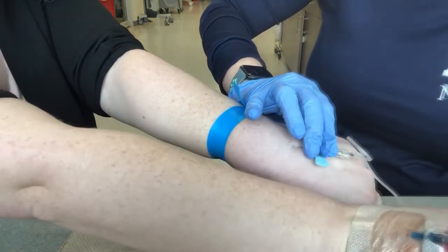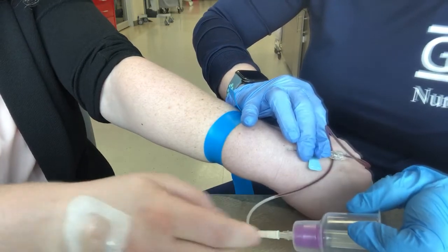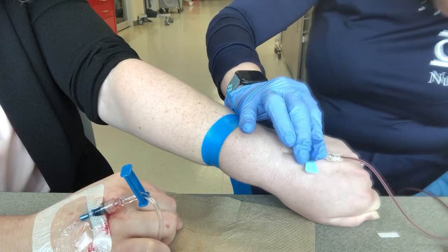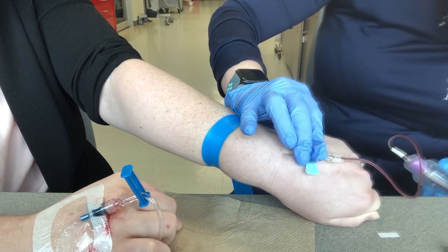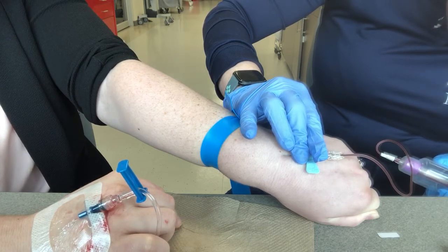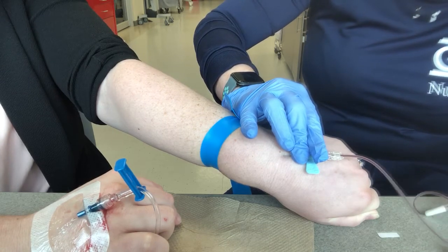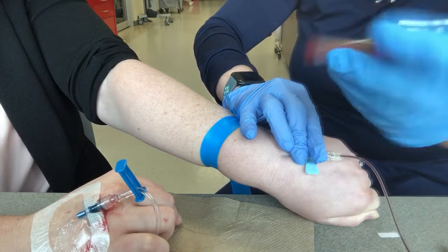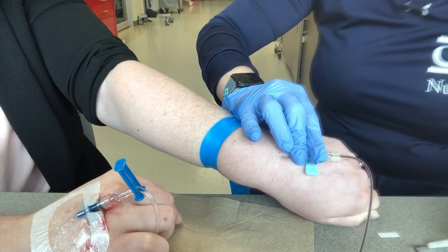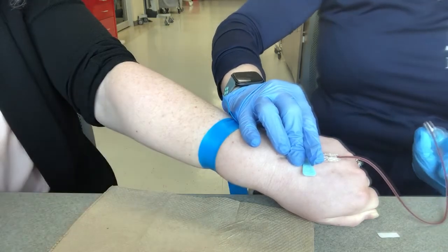I'm not actually putting pressure — I'm just holding the catheter in place. It should vacuum blood into the tubing and into the tube. That looks good. There are times you need the full container. Also, once this thing breaks suction, don't try to shove it back on there — that's how you make things explode. You can then attach your second tube.